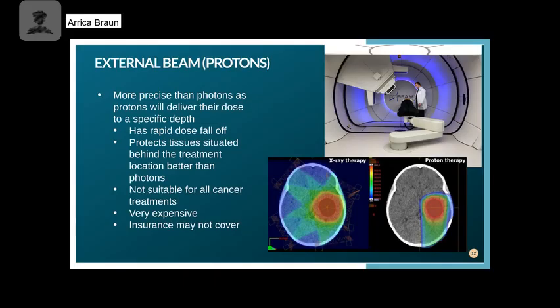Proton therapy is going to be an extension off of the external beam by using particulate radiation, but it's looking at the bigger subatomic particle of a proton. So we talked about electrons already. They're much smaller. They don't penetrate as deeply, so they're more for superficial cancers.